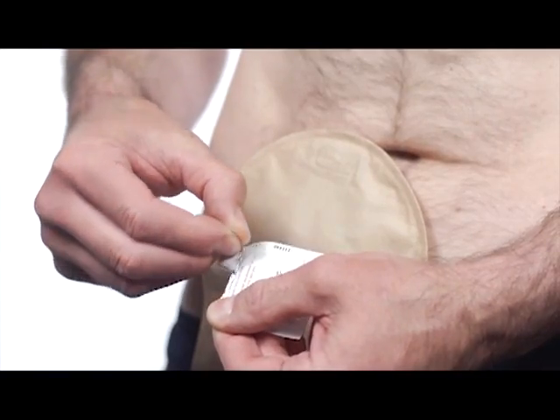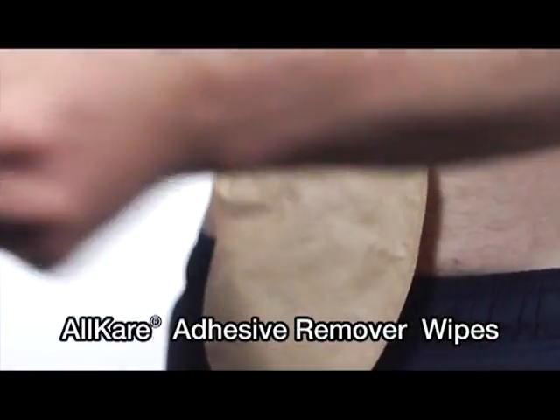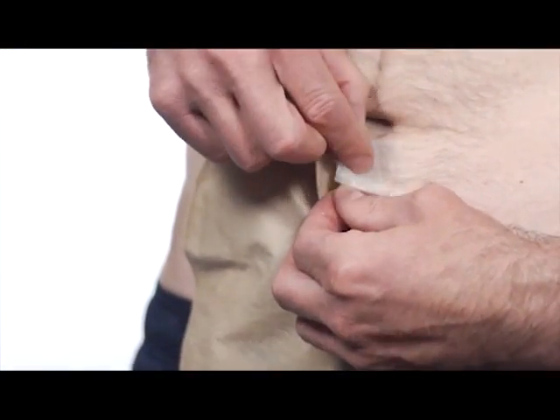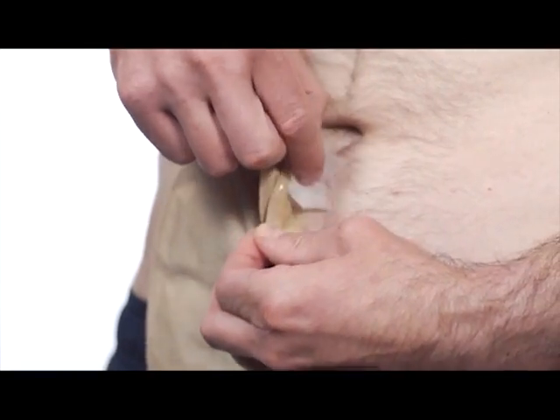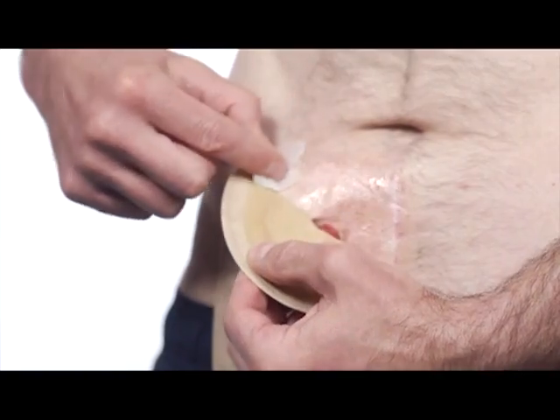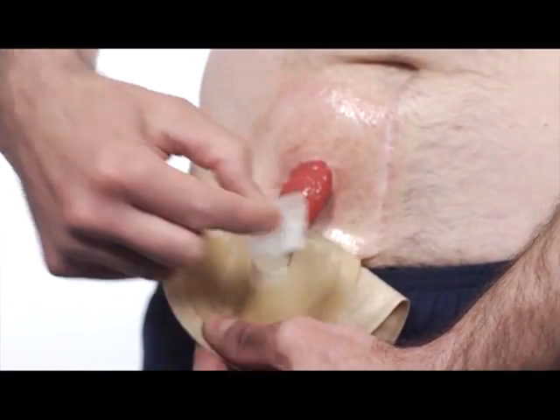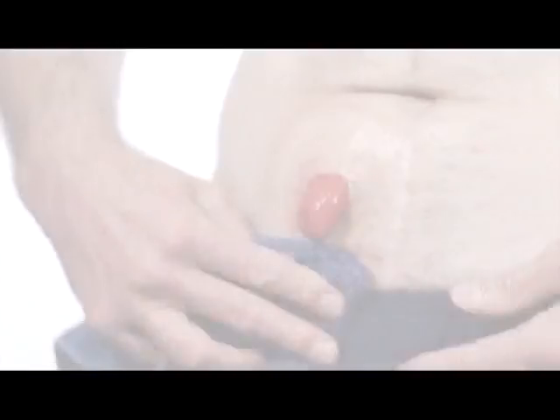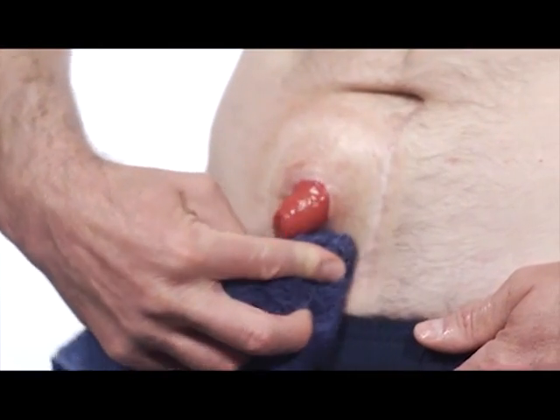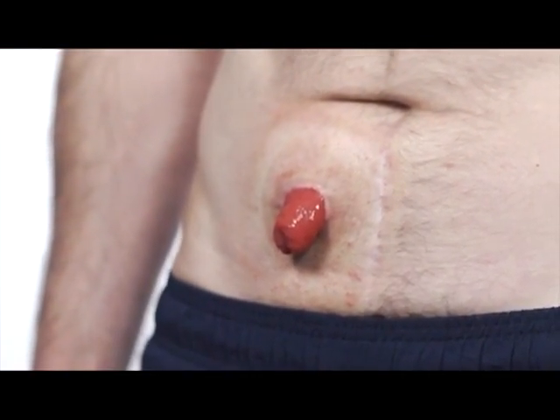To help remove the ostomy appliance, your healthcare provider may have recommended AllKare Adhesive Remover Wipes. These wipes can be used to aid in removal of the pouch and adhesive residue left behind. To use, simply wipe the adhesive remover between the skin and the wafer, gently peeling the wafer back while continuing to wipe. Make sure to clean your skin after using the wipe to remove any excess oils left over. These are not recommended if you have a rash or open sores around your stoma.